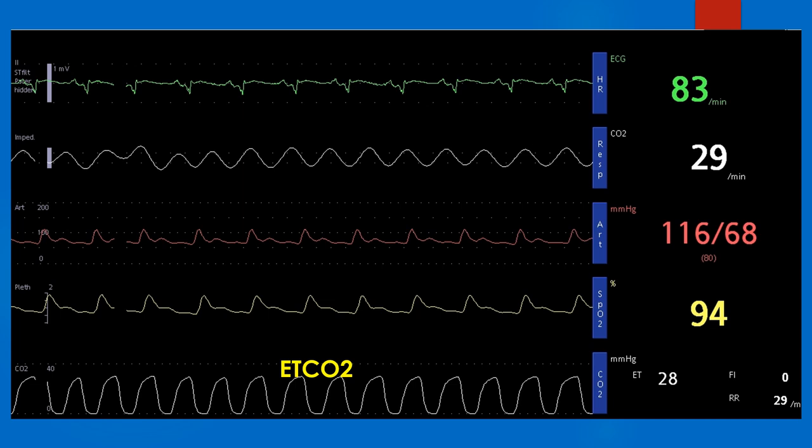The topmost tracing is the electrocardiogram, which shows regular sinus rhythm at 83 per minute. Invasive blood pressure monitoring, usually with a cannula in the radial artery, shows a blood pressure of 116 by 68 mmHg. The remaining tracing is of pulse oximetry, which shows an oxygen saturation of 94 per cent.